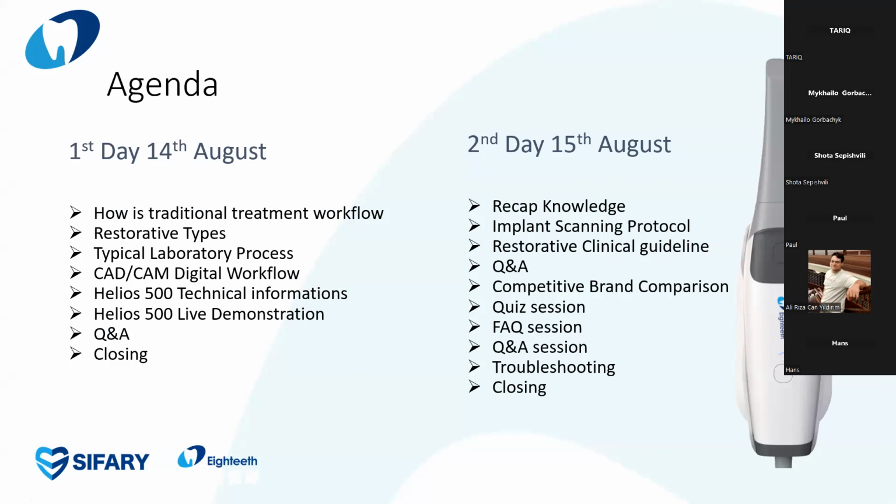Especially, I'm going to focus on the CAD/CAM digital workflow. And after this session, I'm going to start lecturing about our intraoral scanner Helios 500. I'm going to demonstrate how to scan and what to pay attention to. And after that, I'm going to have a Q&A session and closing for today.